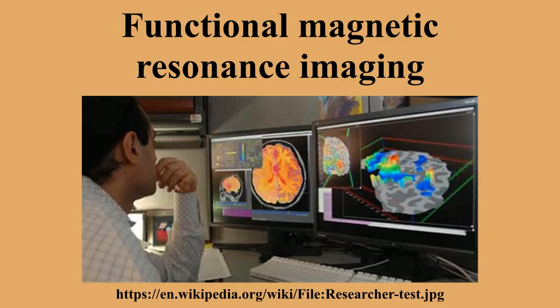Blood flow is not discontinuous as the processing proceeds. Also, both inhibitory and excitatory input to a neuron from other neurons contribute to the BOLD signal. Within a neuron, these two inputs might cancel out. The BOLD response can also be affected by a variety of factors, including disease, sedation, anxiety, medications that dilate blood vessels, and attention. The amplitude of the BOLD signal does not necessarily affect its shape.